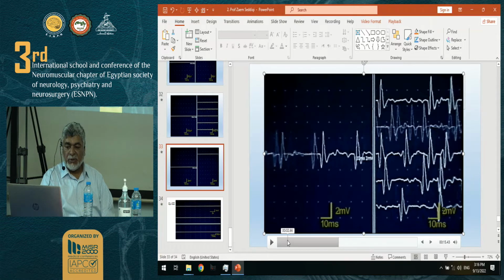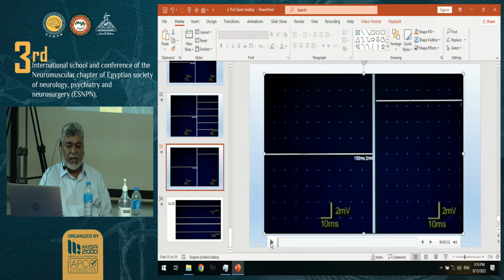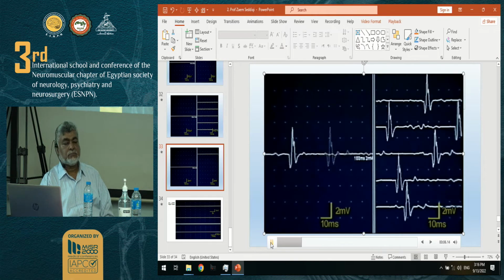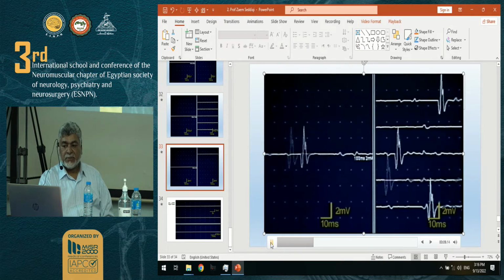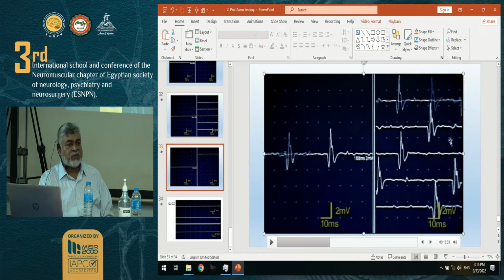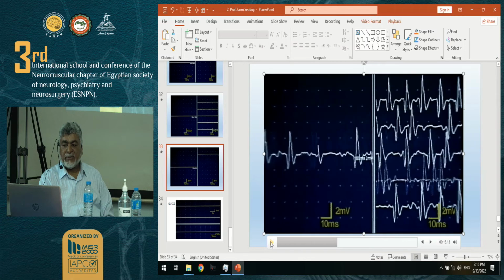And look at that. When you do the interference pattern in this patient, you'll have gaps, it won't be filling the screen. So you already have the information there, okay? Despite effort, it's not bringing in the second motor unit. Look at this, if I increase the frequency of firing, it's now 4 times, about 40, firing 40 times per second. Despite that, no second motor unit. That's reduced recruitment, okay? Neuropathic process. I think I'm coming to the end. I want to show, what is this?